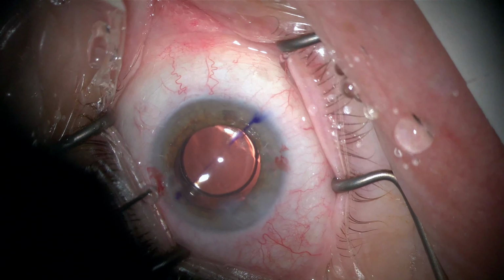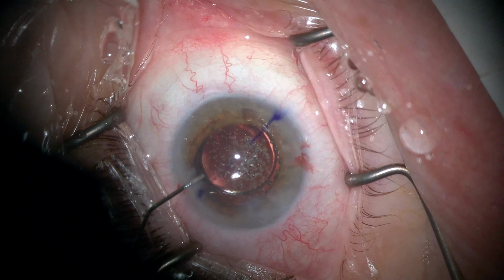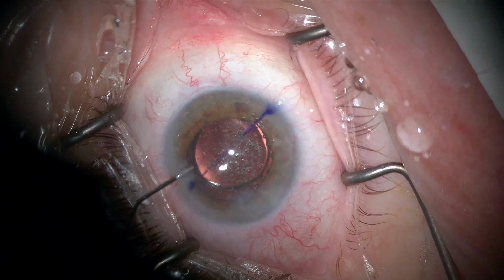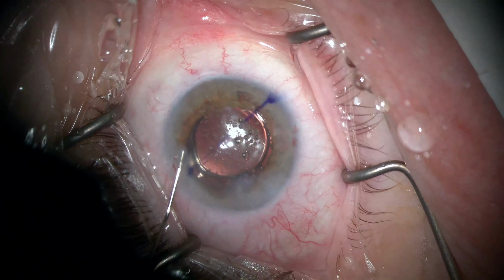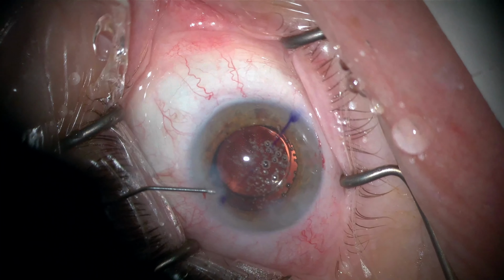And I also spend a little bit extra time just to make sure that the IOP in the eye is really as close to physiologic as possible, so that there's no shallowing or deepening of the eye in the postoperative period.